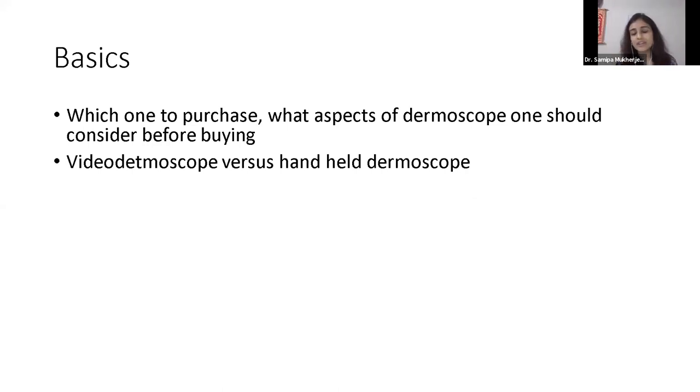Yes, sir. I think while you are choosing a dermatoscope, the thing that you cannot compromise on is the optics. So long as the optics of the dermatoscope is good, I think you are good to go. Second thing, as Dr. Enzo also said, a video dermoscope is cumbersome because you will require a monitor and attachments. And if you have a practice where you are visiting multiple setups and clinics, it becomes a little difficult to move the whole thing around. The handheld dermoscopes are mostly pocket dermoscopes, and with the zooming facility, the magnification and visualization of the elements is quite good. Even for trichoscopy, handheld dermoscopes give us a very good image for clinical correlation.